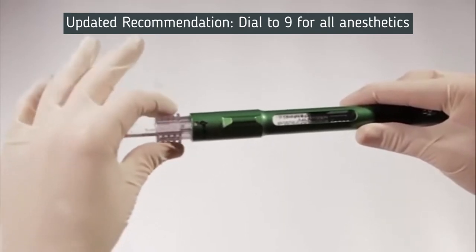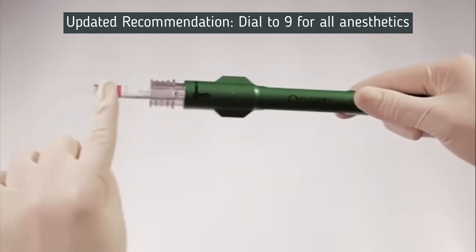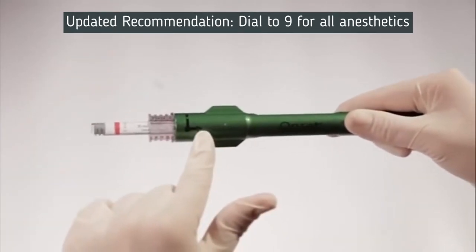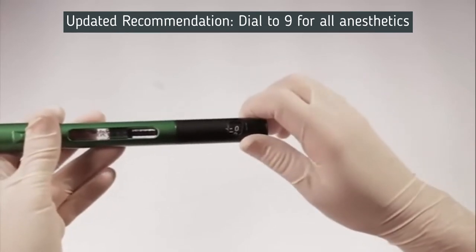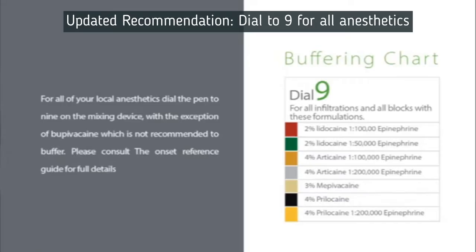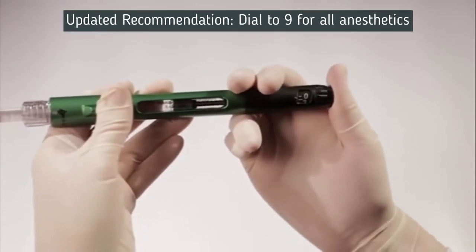Once the cartridge is fully seated in the number 1 position, grip the connector with your thumb and forefinger and turn clockwise approximately one quarter turn to the number 2 position. This step will lock the 1.8-milliliter cartridge in the connector. Next, push the connector forward to the number 3 position. In the number 3 position, you have established a sterile fluid path between the two cartridges. Turn the volume dial to the desired amount of solution to be dispensed from the 3-milliliter cartridge to the 1.8-milliliter cartridge, then depress the dispensing button straight in to mix solutions.